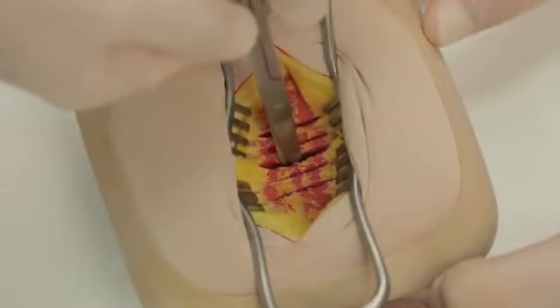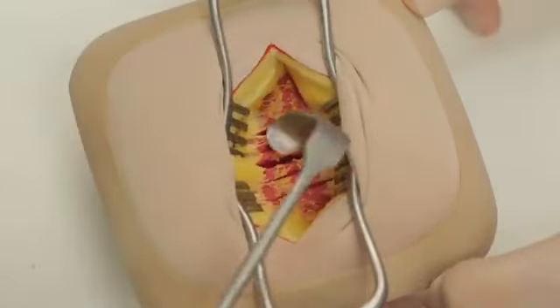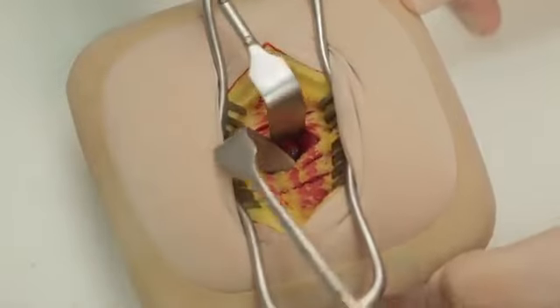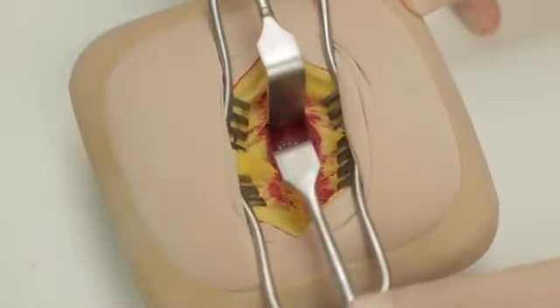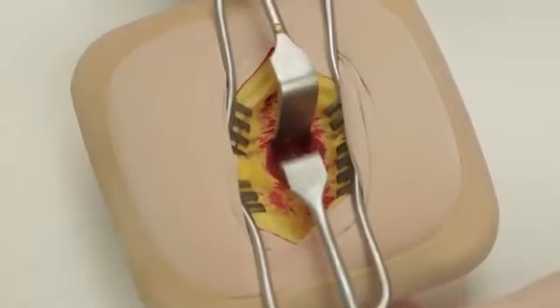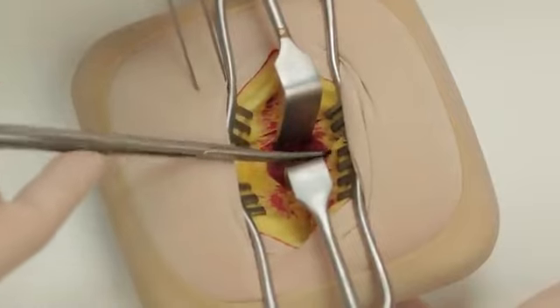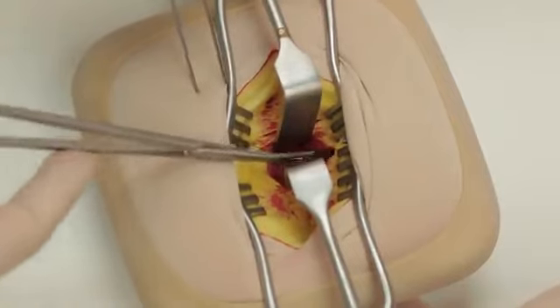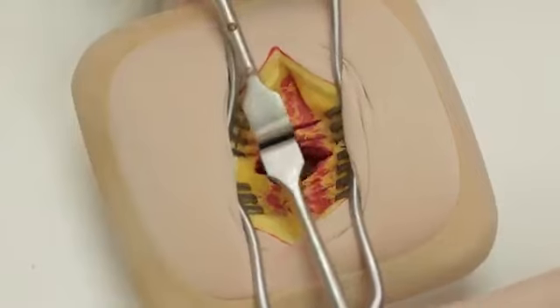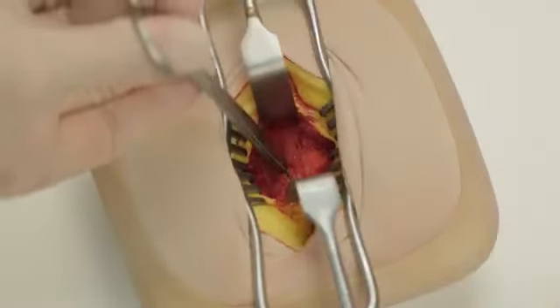We have purposefully scored this model to demonstrate the technique, although in the models with which you are presented, this will not be evident. The split can be widened using Langenbeck retractors to display the muscle underneath. Transversus abdominis should also be split in the line of its fibres.